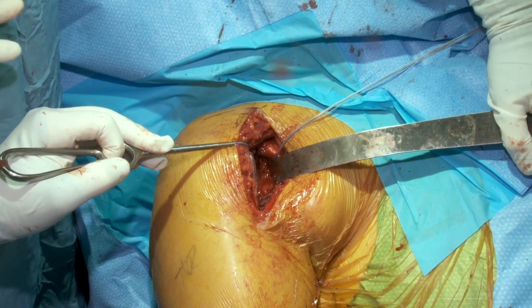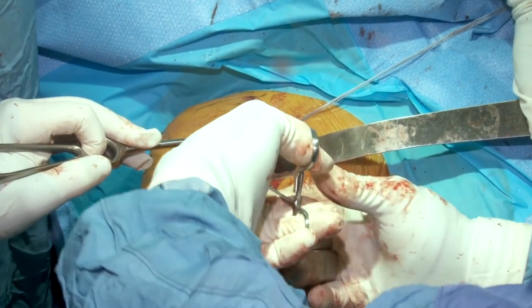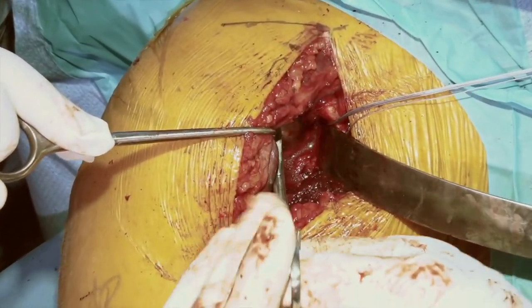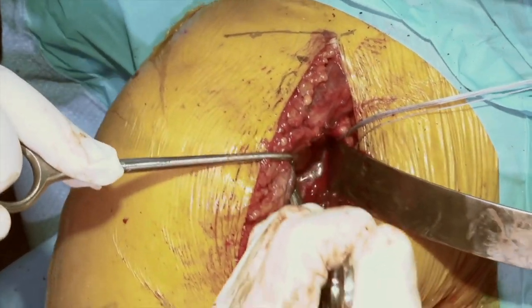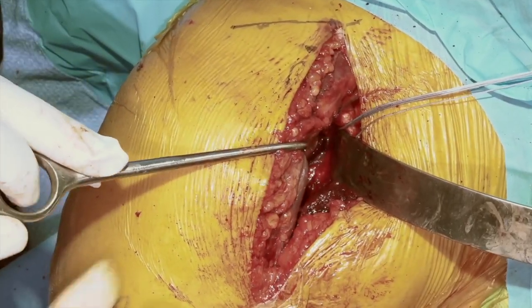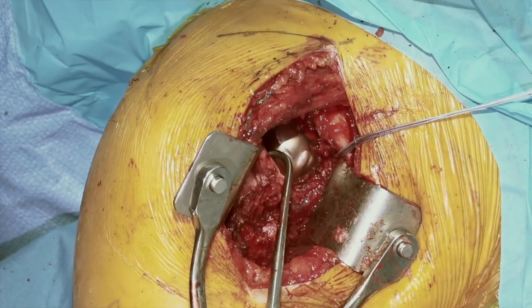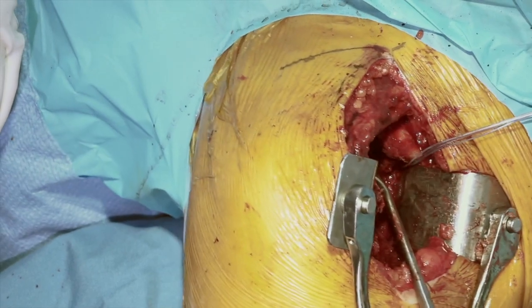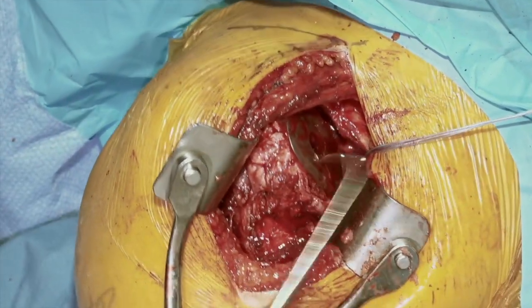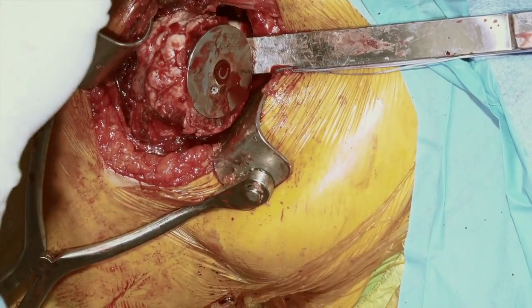We'll take our clamp, wrap it around the glenosphere, and check that our Morse taper is engaged. We can literally lift the patient off the table — so this is plenty of security. Then we'll take our bone hook, put a little traction, slide forward across our glenosphere, and pass past the glenosphere. We'll slide underneath our deltoid and hold that straight up.